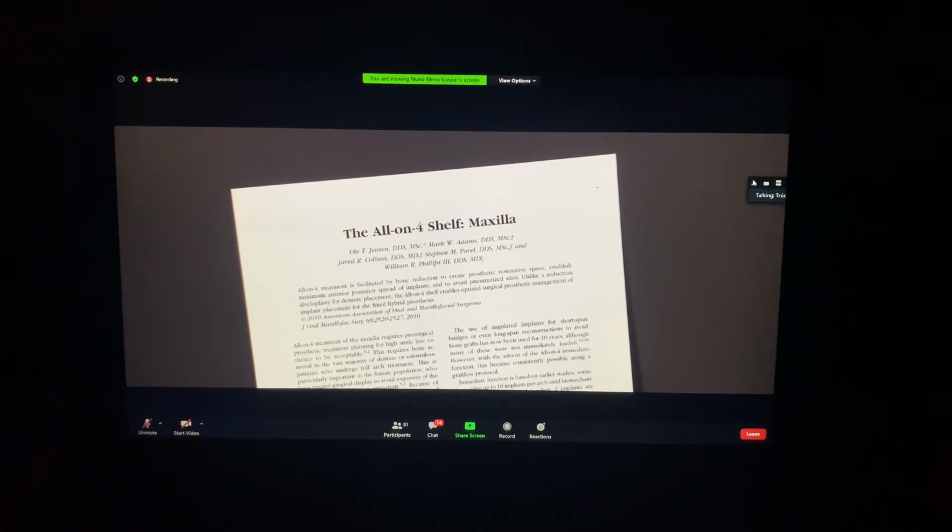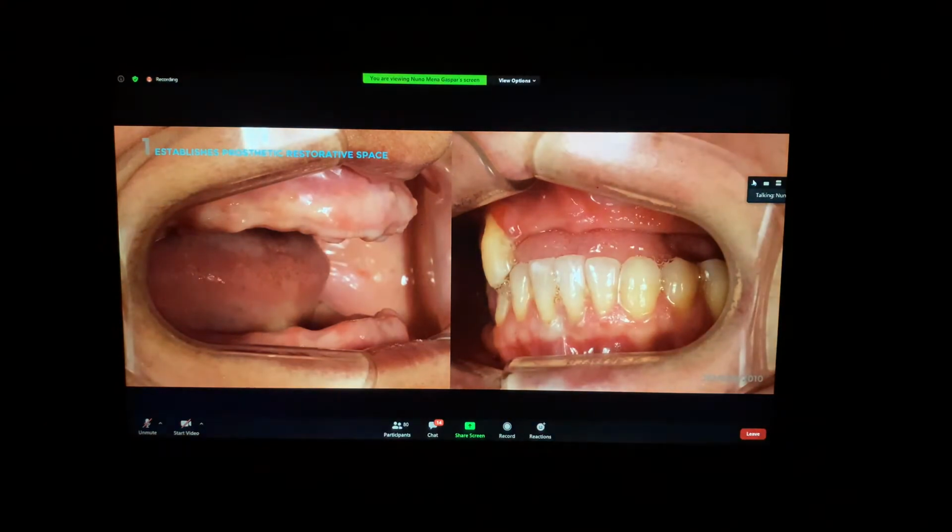Trong cái bài này, chúng ta sẽ giải thích tại sao lại cần phải mài chỉnh xương, và mài chỉnh xương như thế nào và tại sao. So, bone reduction on maxilla is done because first of all we need to establish restorative space.